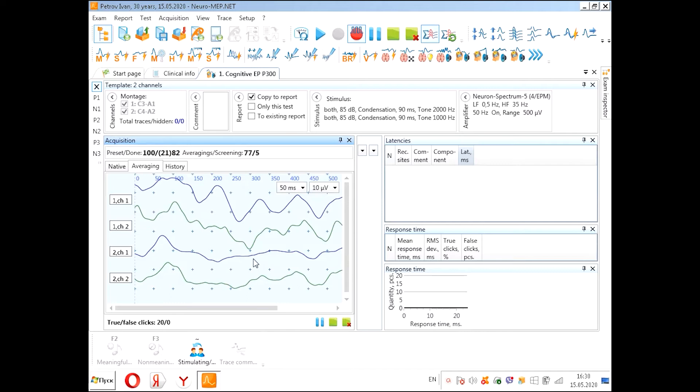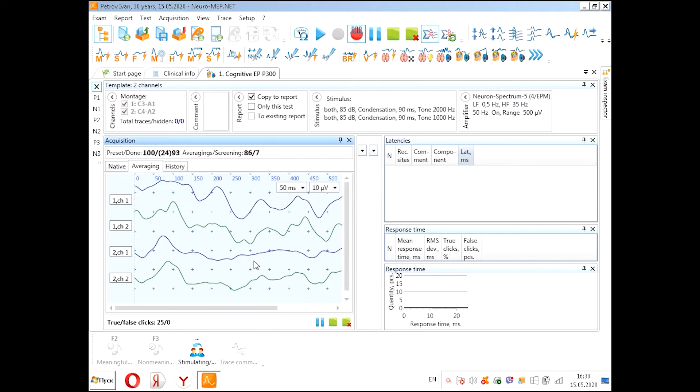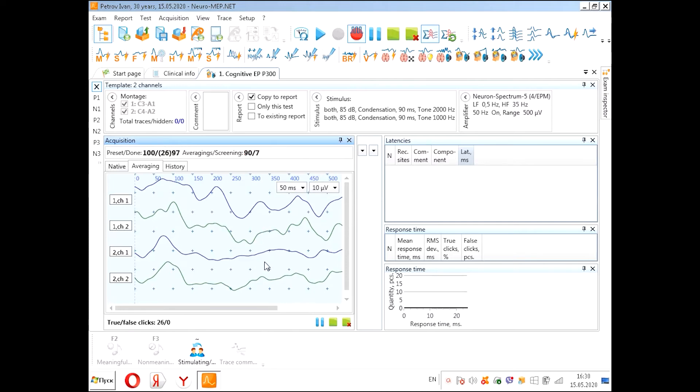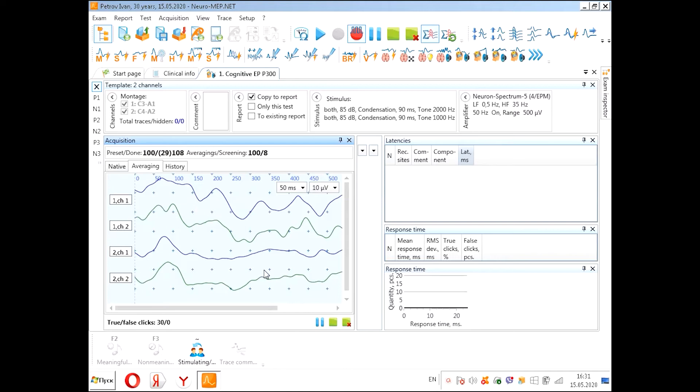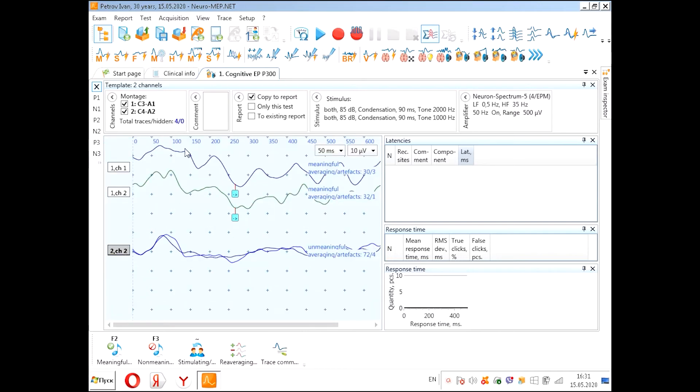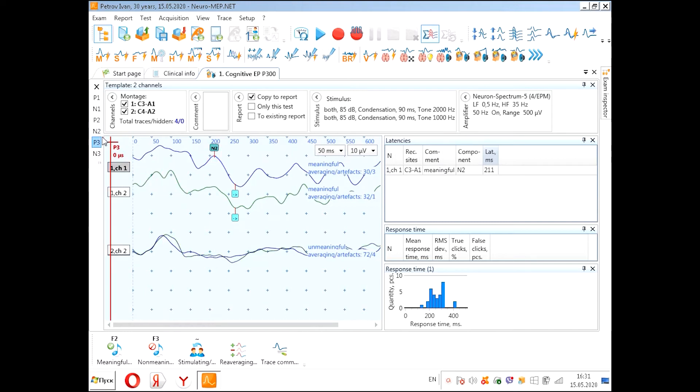We have finished our acquisition. Now we can see the curves for meaningful stimuli from the right and from the left side. Here, only sensory part of our neurophysiological response we see, and here we see the sensory part and the cognitive complex including N2 and P3.